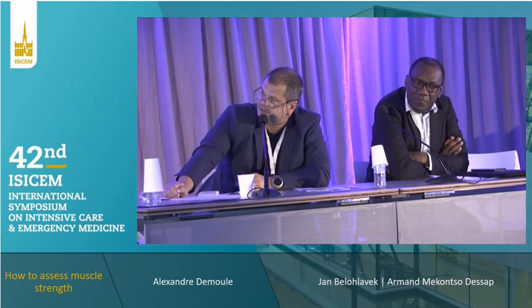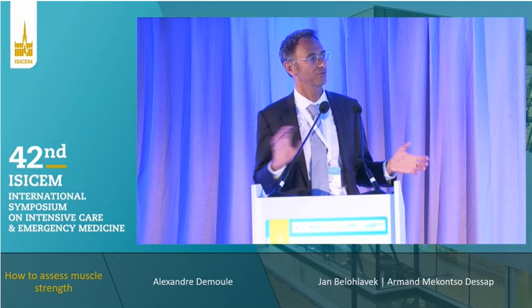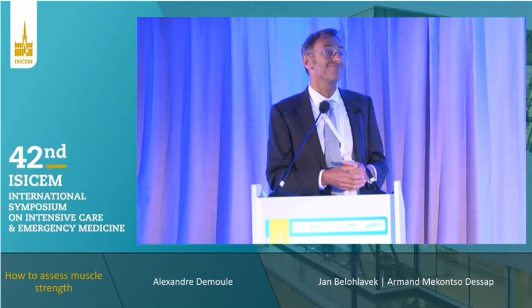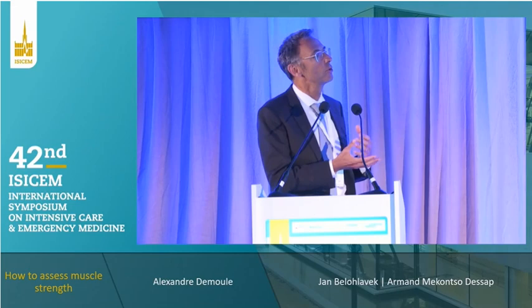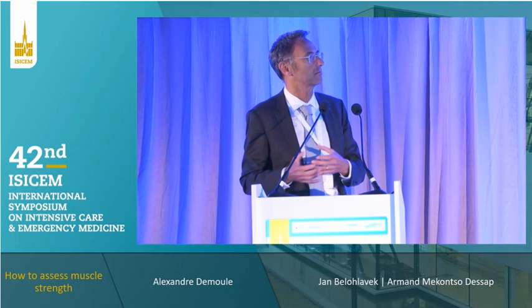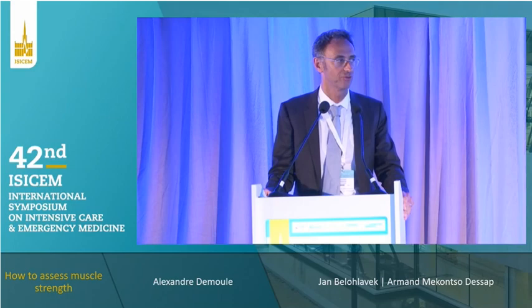That's an excellent question. I don't think it has been evaluated. I don't think there are studies like diaphragm strength in the morning, diaphragm strength in the afternoon, comparison between those two measurements. What we do is in general in the morning. We do both actually, because sometimes we do SBT in the morning, and we wait a little bit, and in the afternoon we do diaphragm ultrasound. The patient fails SBT in the morning, and we decide at lunchtime we need to evaluate this diaphragm, and we do it in the afternoon. So, no, I cannot give you a clear recommendation regarding what time of the day we should do this assessment.